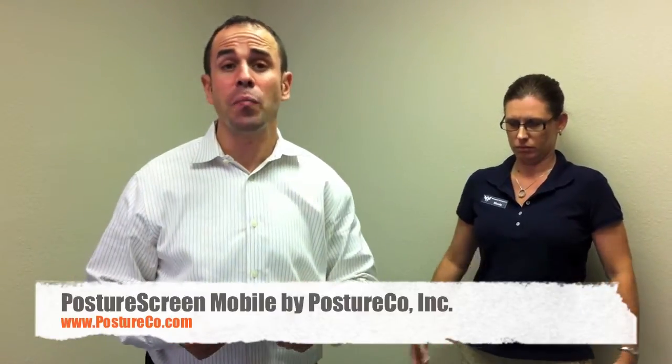What we're going to do today is go over Posture Screen Mobile — how to calibrate and position the iPhone or the iPod Touch, in this case the iPad 2, when you're going to do a Posture Screen with your subject or Nicole, so to speak.